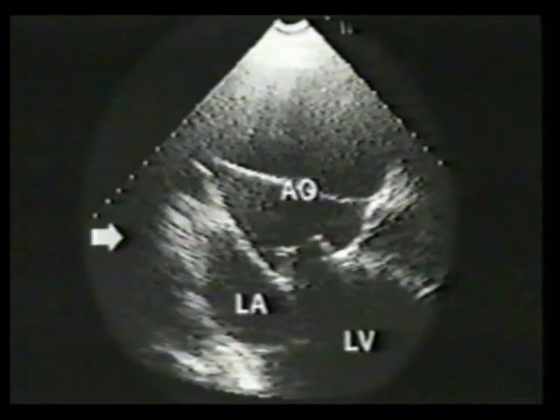This view was obtained with a transducer in a right parasternal position. With enlargement of the aortic root, this view becomes quite useful. This is the aortic valve, and this is the mitral. In real time, you will see that the intimal flap moves upward when the aortic valve opens. It is pushed by the blood ejected with systole.